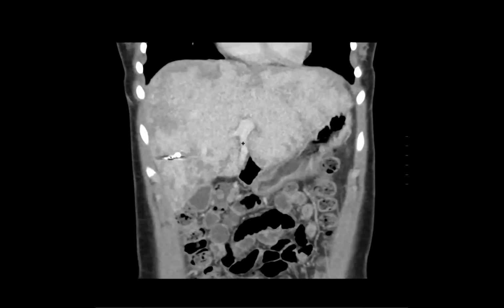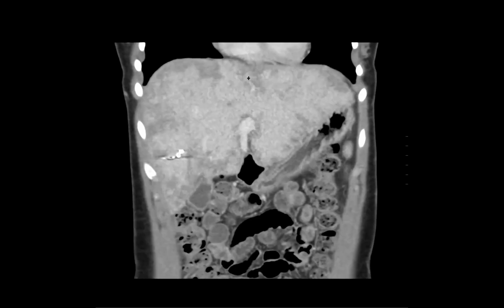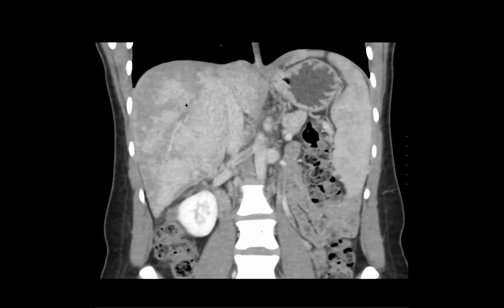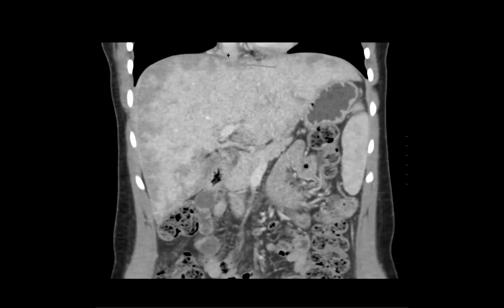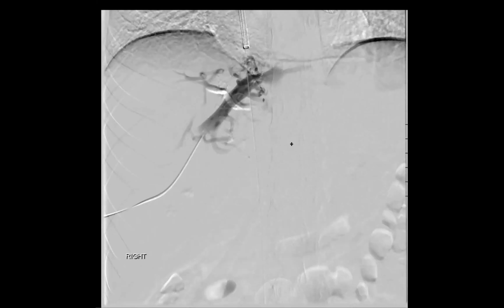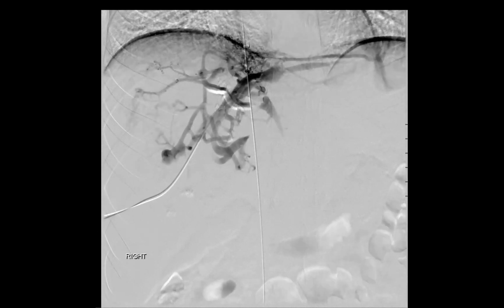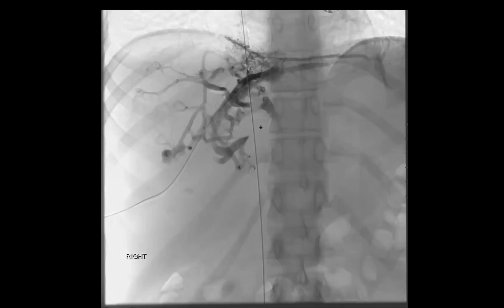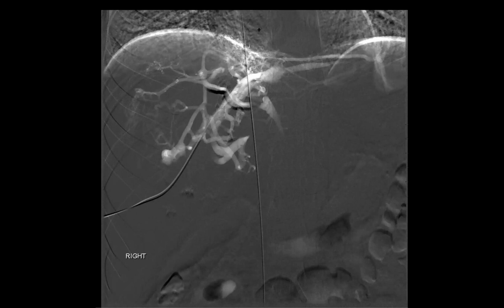Here's the venous phase. So you can see the middle, and then the left, the right I don't see very well here. Here it looks like it's thrombosed. And then where it's occluded is at the confluence up here. And then we can see that that was confirmed angiographically. So they did a transhepatic access, and there's all of this collateral formation that drains into the internal mammary veins, which I can show you on the CT, but there's no return to the IVC because of occlusion at the confluence.